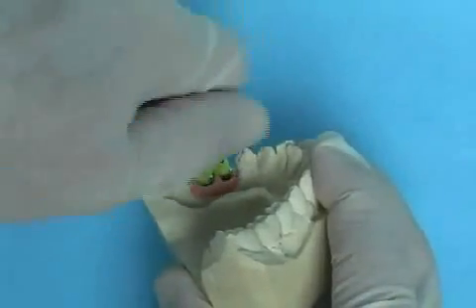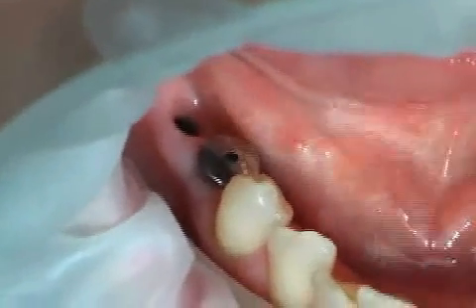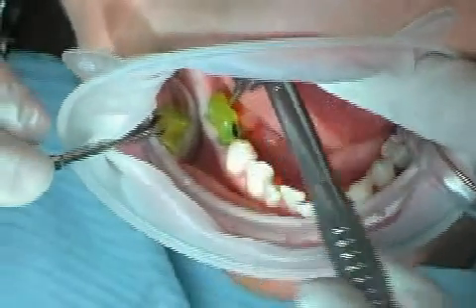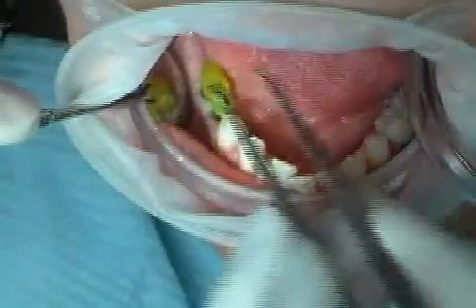Afterwards, the two abutments, including the positioning template, are released from the plaster model. Meanwhile, the gingiva formers are removed from the implants in the patient's mouth. Afterwards, the abutments are placed on the implants in the correct position, thanks to the use of the positioning template, and are soon after tightened with a torque ratchet.